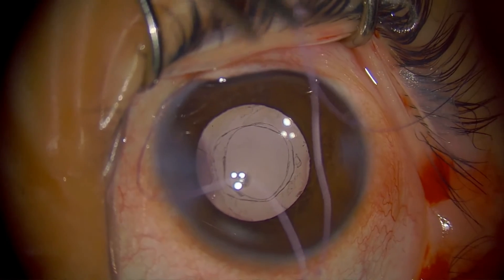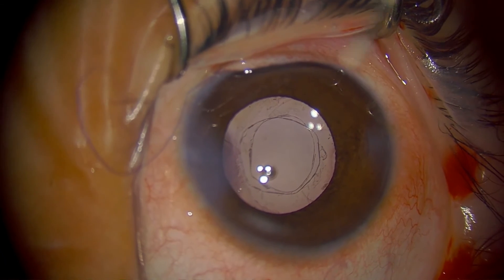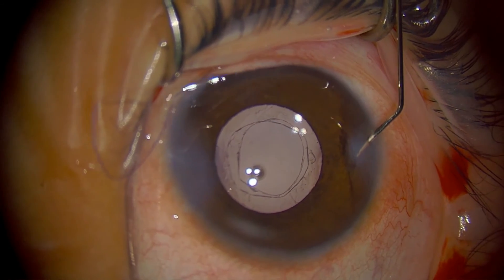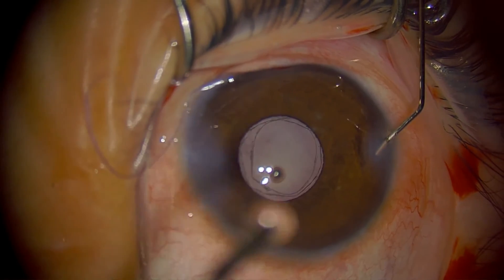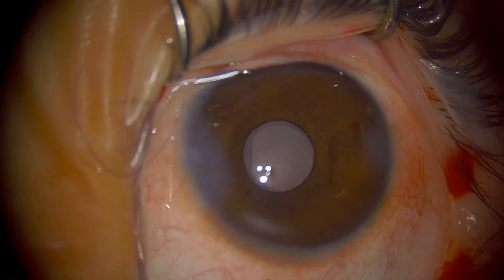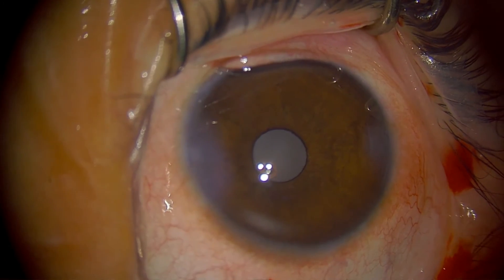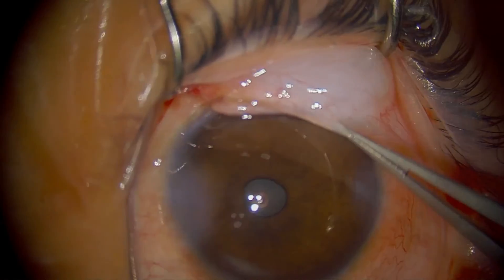They can get glasses usually within a couple of weeks if they need it. Because he's older, I was able to hydrate the wound and get it closed very quickly, so the chamber is maintained already. We have a nice capsulorhexis, so we don't really need Miochol if we don't have it — but I'm going to put it in just to get the pupil down. In a younger child, because the chamber collapses, it's useful to use Miochol to bring down the pupil. The central visual axis is clear now — we have an anterior capsulotomy and posterior capsulotomy. Hopefully this is the only surgery he's going to need. I'm going to patch him for 24 hours. Thank you very much.